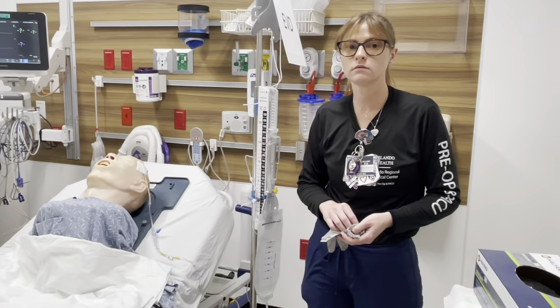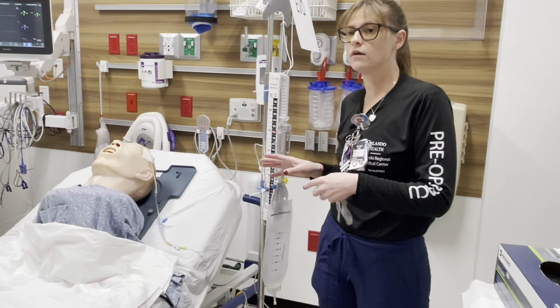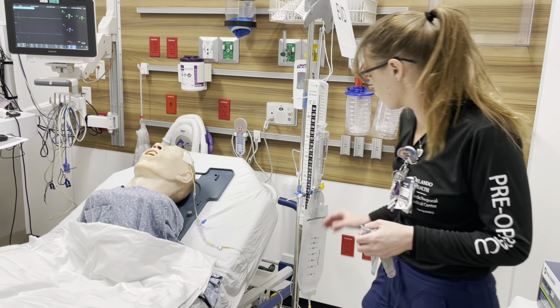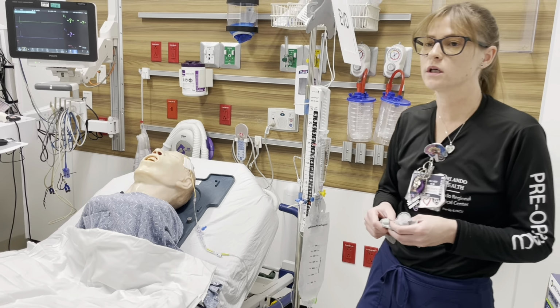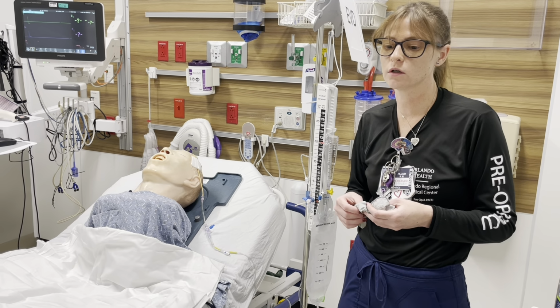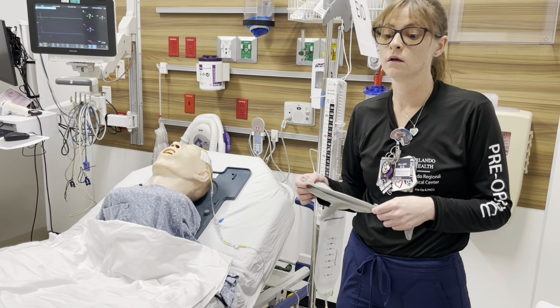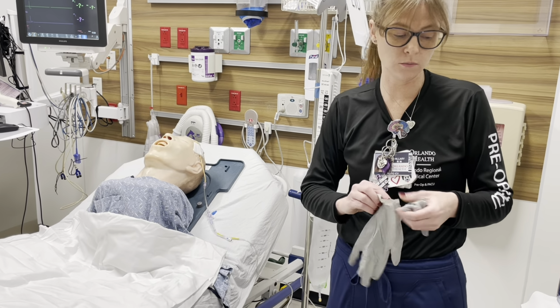Okay, so now that we are all level, we've made sure that all of our stopcocks are closed, and we know what our orders are, we can go ahead and start setting up the transducer, so that we can monitor our ICP, and so that we can correctly drain some CSF if need be.